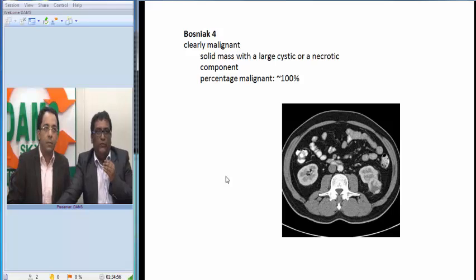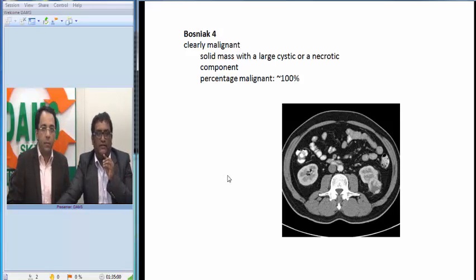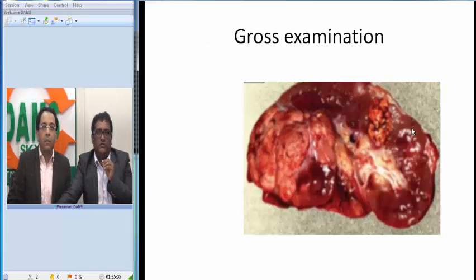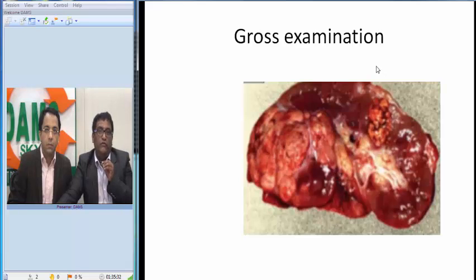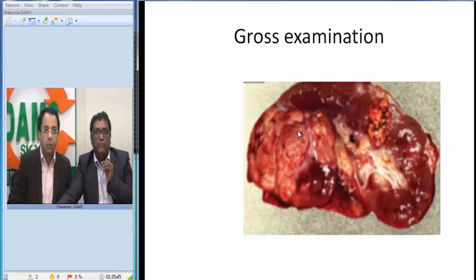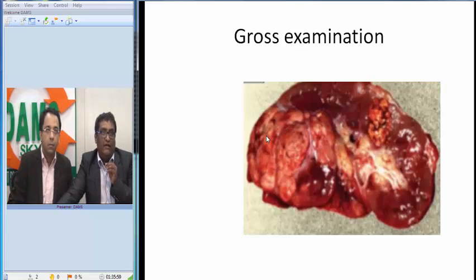Since the CT suggested malignancy, the surgeon performed excision of the kidney and tumor. Grossly, we have the whole kidney. I can see normal renal parenchyma — the normal cortex, the normal medulla — and one of the major calyces joining into the pelvis. Correlating with the CT findings, there are multiple cysts visible. There is also a large mass that does not appear like normal cortex or medulla — this is probably what was seen on CT as a Bosniak class 4 lesion.